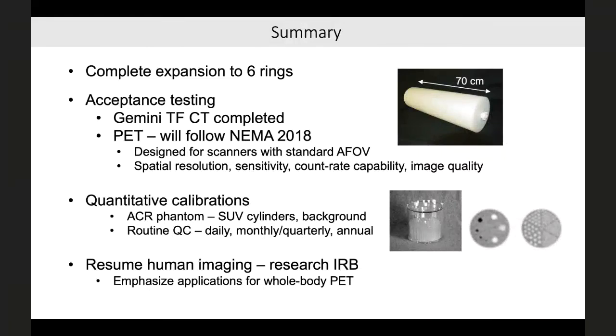It improves effectively the sensitivity, so a factor of 2 improvement in timing resolution translates to an effective improvement in sensitivity by a factor of 2 by virtue of the fact that you reduce the variance in the images. It also improves the quality in such a way that for local distributions you're much less sensitive, or it's a way of getting a localized reconstruction. So if you have effects of high activity distributions or high attenuation that are distant in the body, if you have a better timing resolution, you will be completely insensitive to that. And so these are some of the ways that the timing resolution not only improves your overall sensitivity, but also the localized signal to noise and mitigation of any effects from both attenuation and activity distributions. It also reduces artifacts, which generally we don't suffer from. So in general, I hope I've answered that question.